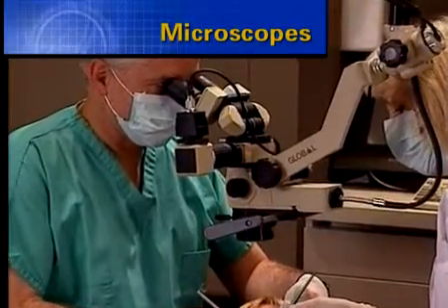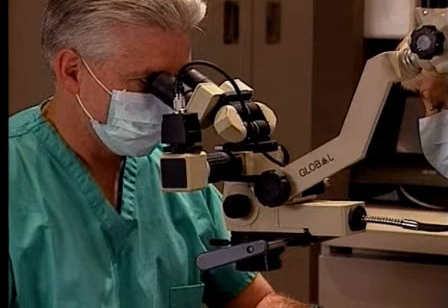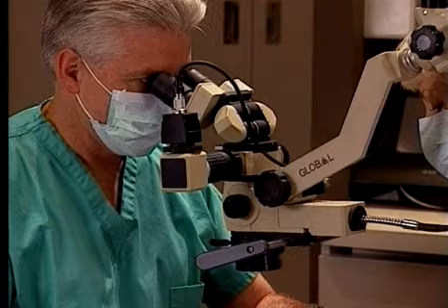Microscopes play an essential role in locating canals because they give us unsurpassed vision and coaxial light. We also have a range of power between 2.5x and somewhere around 20 power.